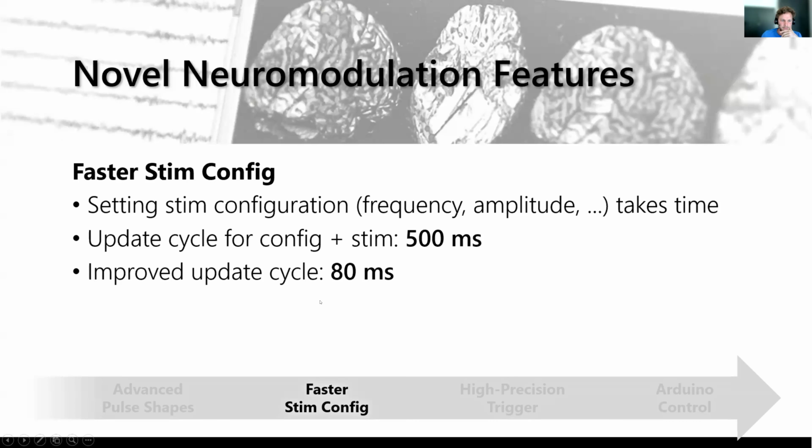So here we were able to make the stimulation configuration much faster. Previously we were at 500 milliseconds, but we've improved the firmware and software, so we are able to update the stimulation parameters at a rate of 80 milliseconds now.